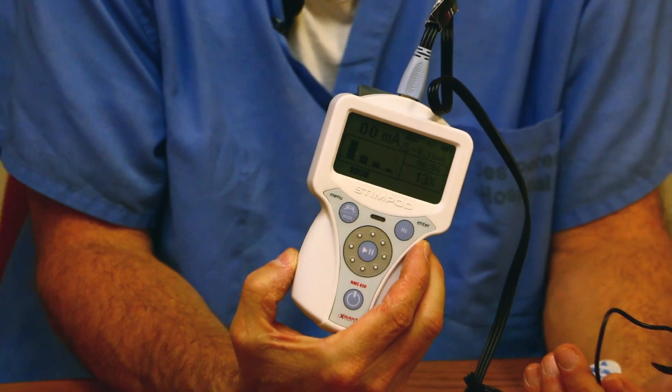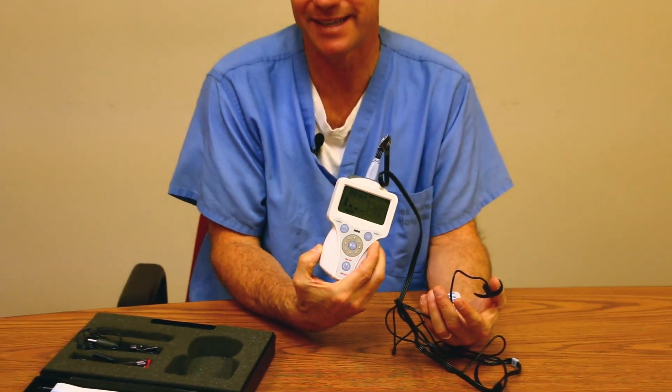It gives you an actual reading, so what's nice about the monitor is I get a definitive number on the muscle relaxant that's on board. You can set up protocols where if the reaction is 90% or above, then it's safe to extubate that patient, or if it's lower than 70%, then you would not want to extubate. This prevents residual block being present in the PACU, for example.